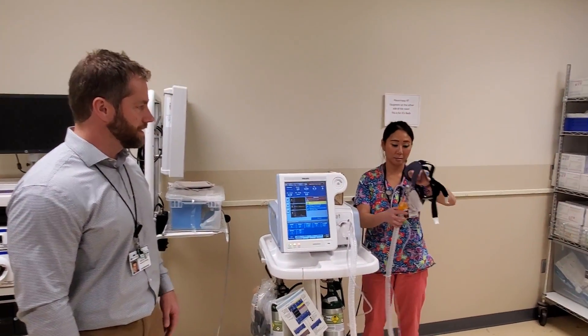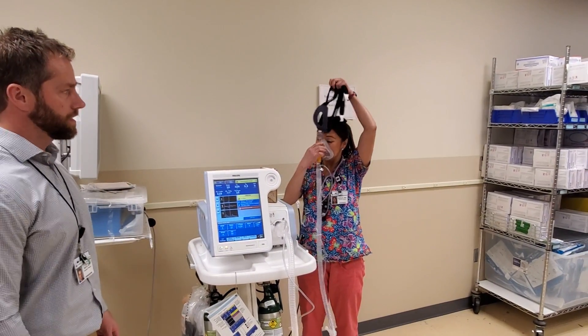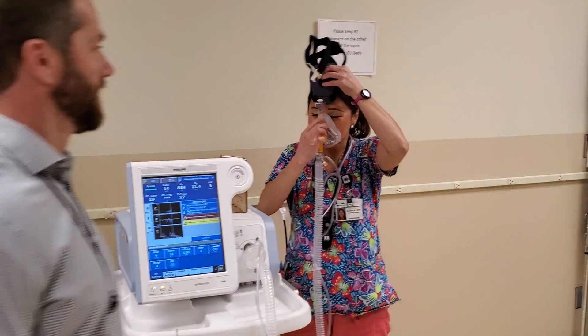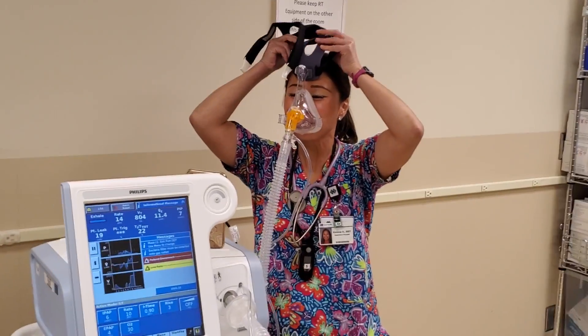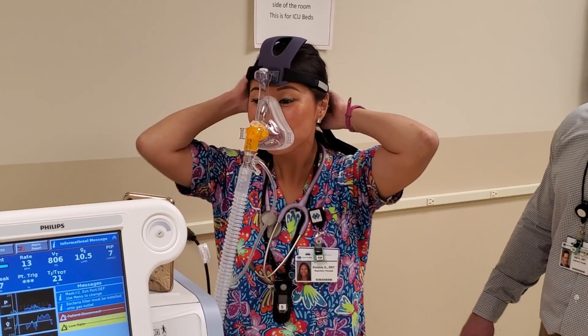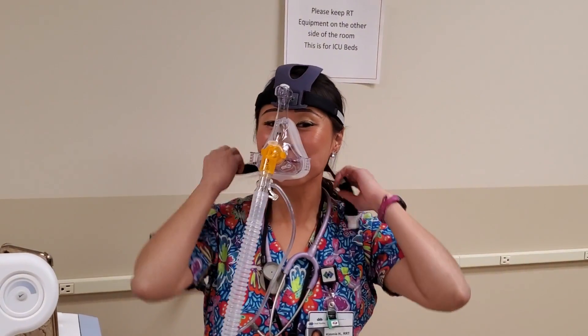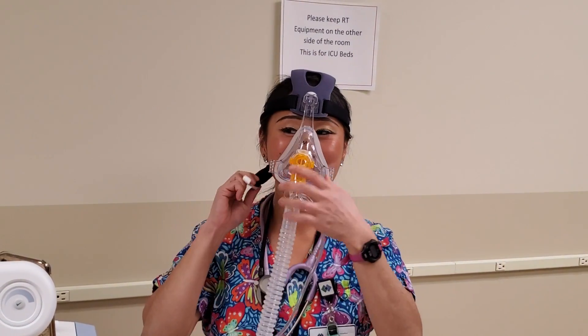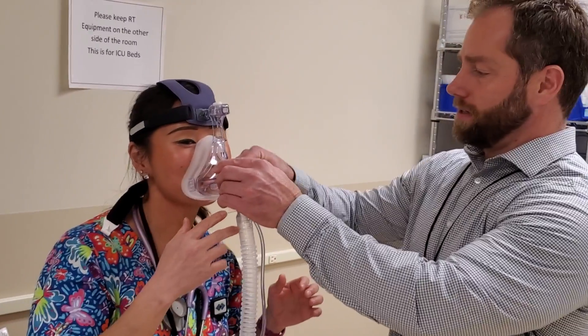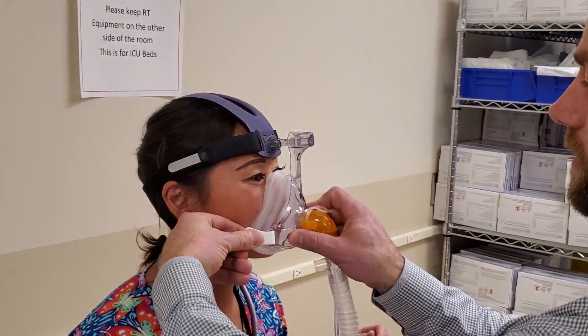This patient knows how to put the mask on — she has experience with it. These clips just clip on right there.